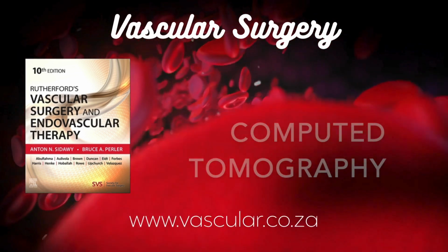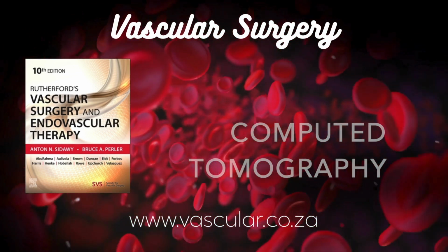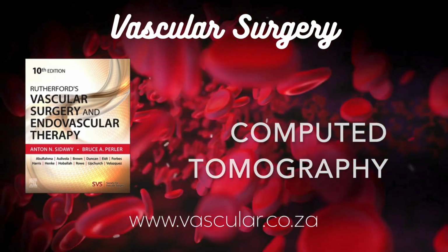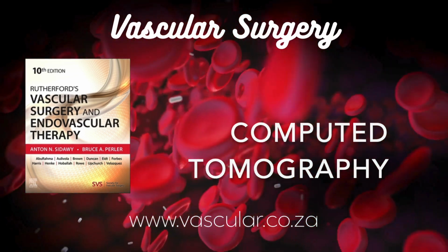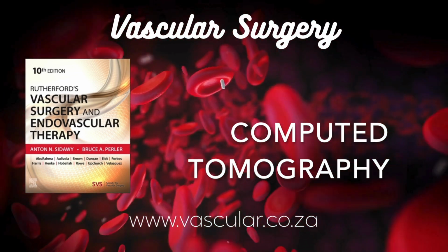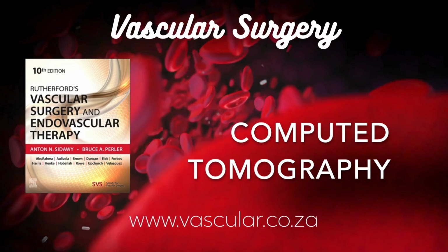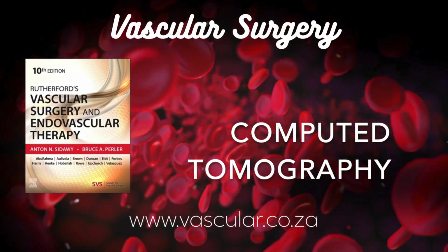Exactly. You can generate time density curves to quantify perfusion. It needs scanners that can cover a decent area quickly, so high slice count scanners, like 256 slice or more, are ideal. It's mainly used for brain perfusion, like in stroke, and cardiac perfusion. Got it. And ECG-gated or triggered scanning.